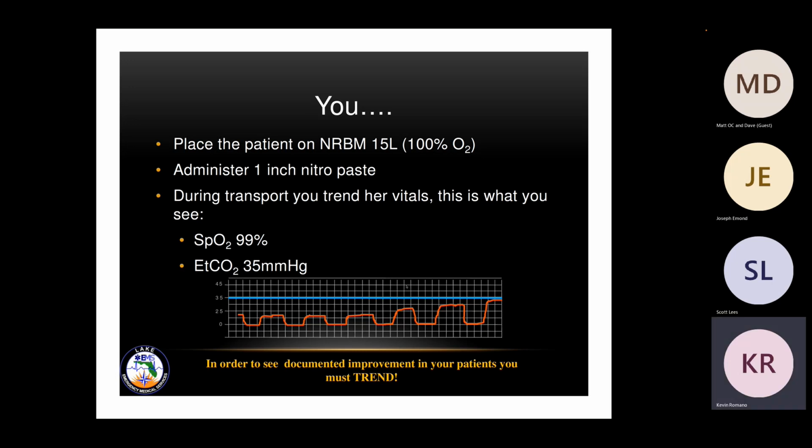In order to see documented improvement in your patients, you must trend your patients, right? So that's getting vital signs every 5 minutes, right? You want to see that trend and record it.